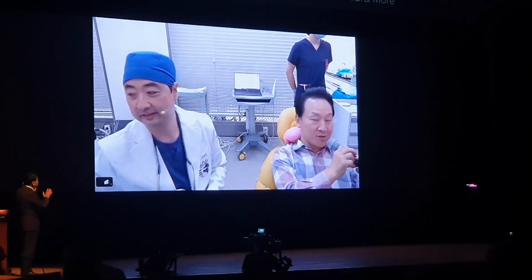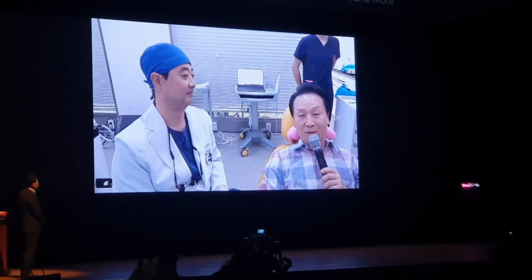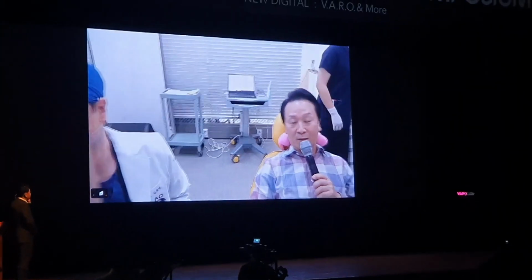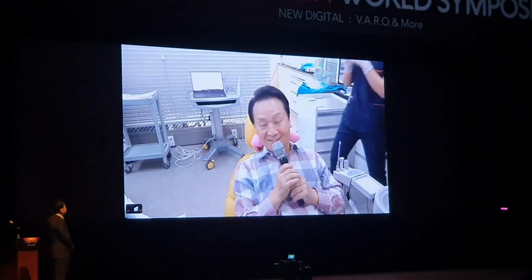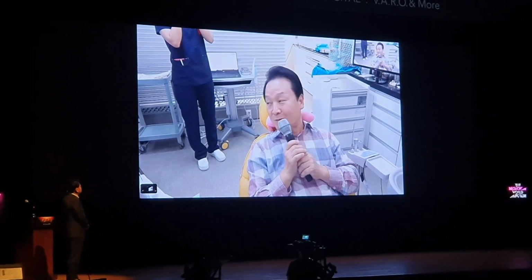Doctor, please say hello to the audience. Great to see you, everybody. I rushed down here as soon as I finished my lecture. Currently, I have missing tooth number 16, so I decided to allow Dr. Kim to perform live surgery on me today.